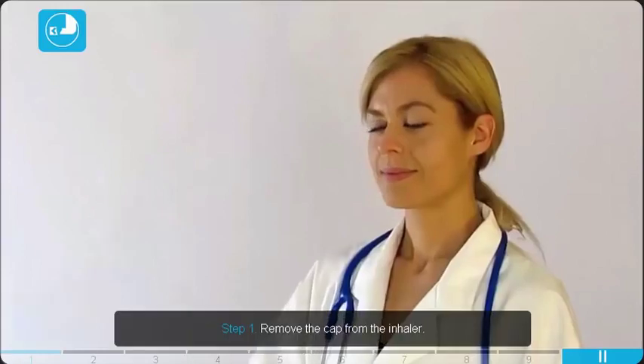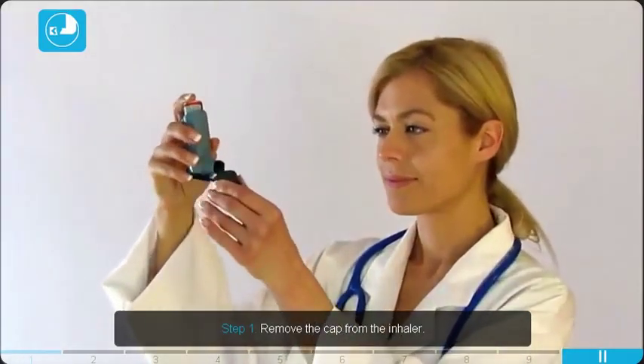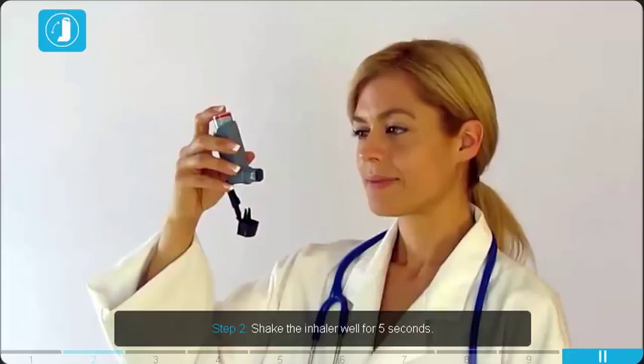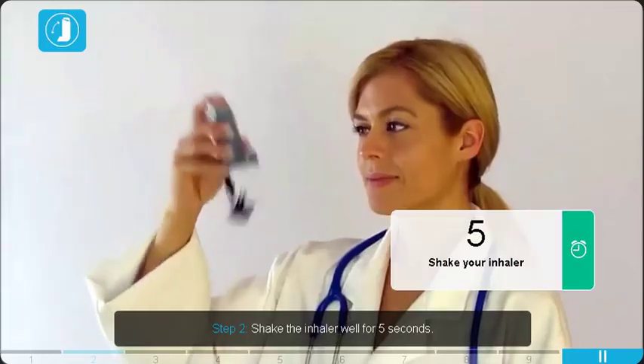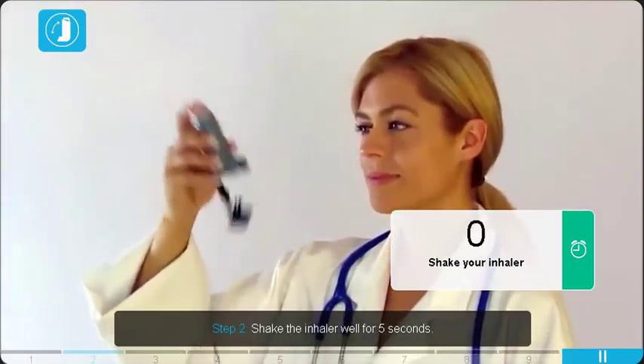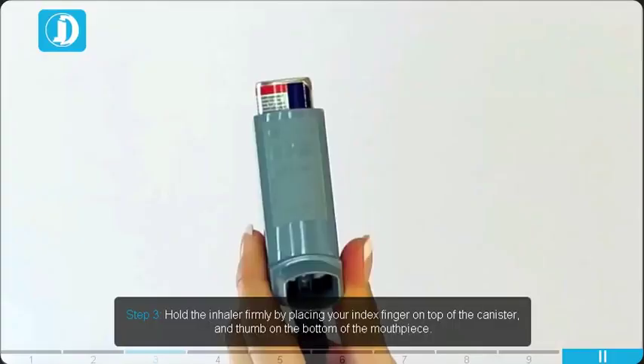Remove the cap from the inhaler. Shake the inhaler well for 5 seconds. Hold the inhaler firmly by placing your index finger on top of the canister and thumb on the bottom of the mouthpiece.